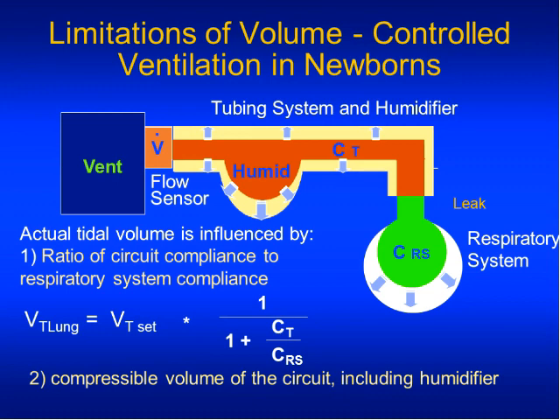So great. Well, we have ventilators that can deliver controlled tidal volume, right? We have volume-controlled ventilators. We use them all the time in the adult and pediatric ICUs.